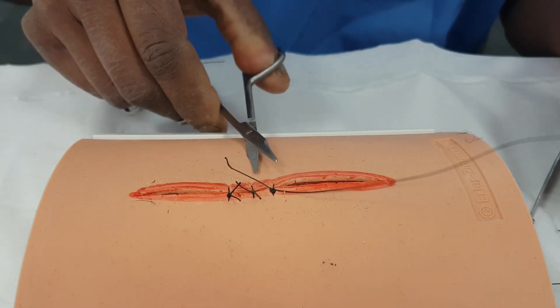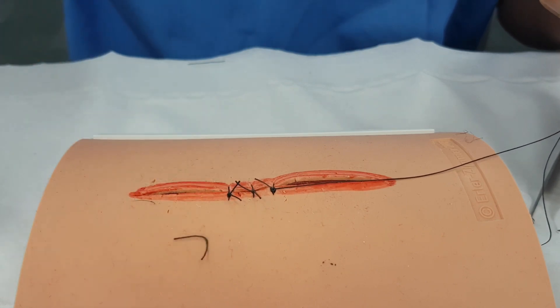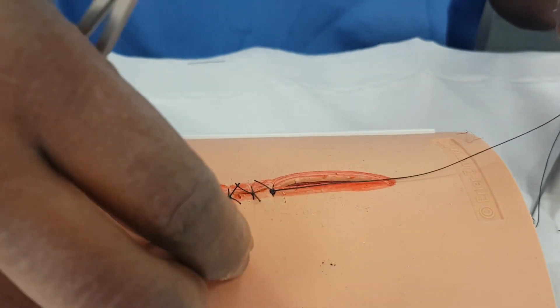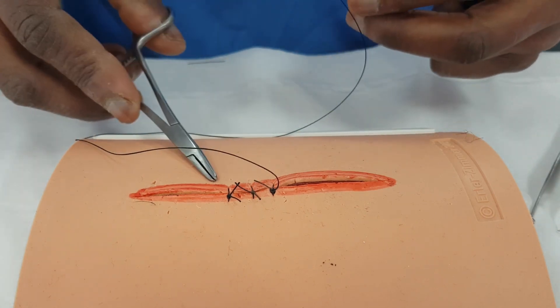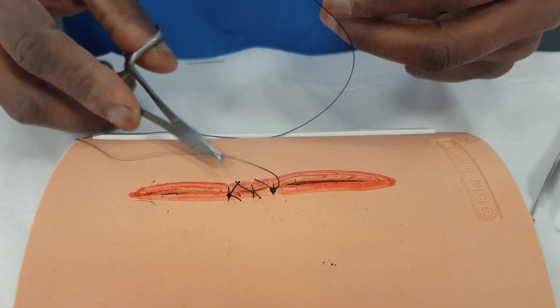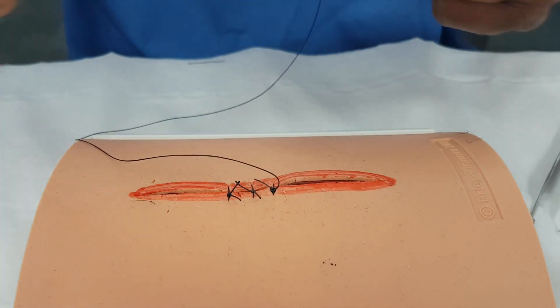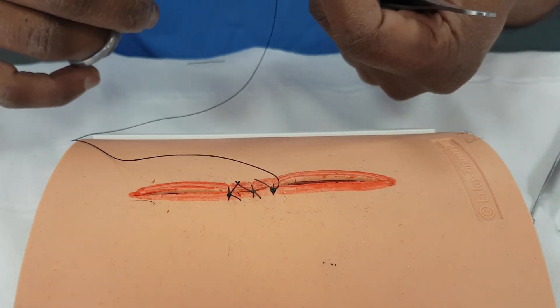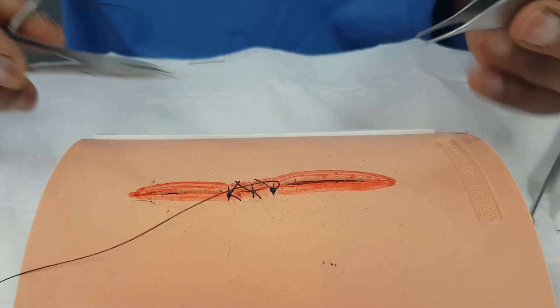And what we'll do is make our stitch continuous. Why would we use a continuous stitch? Well, if we want to have a wound that's uneven made even by tension and pressure, we can use interrupted. If we want to sew something up that's relatively straightforward and doesn't have any areas that are gaping or under tension, a continuous is nice and easy and quick.